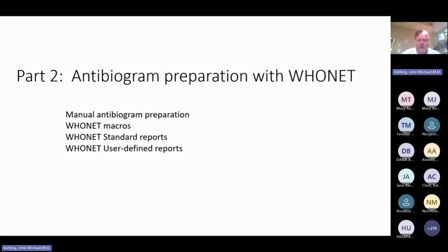I'm in control. Once you've done that, I can show you how to make a macro so that you can repeat the test a month later, a quarter later, a year later. Macros are extremely valuable for repeating things over time. First, you learn how to do it manually, and then you save it as a macro.